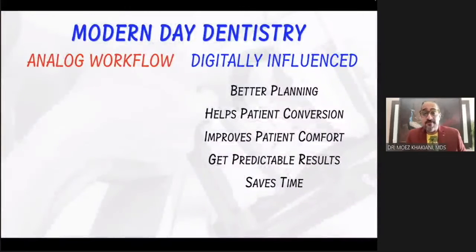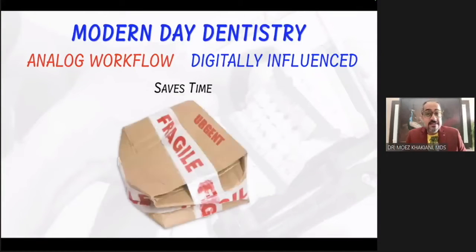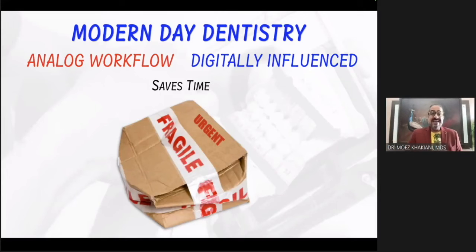And last but not the least, of course, it saves time, right? Why does it save time? Because a whole lot of our time is spent in sending work to the laboratory. खर्चा भी होता है, वक्त भी लगता है, गुम भी जाता है, टूट भी जाता है. अरे यार, ये सब मच कब जाएगी? And that, friends, is again where digital technology comes in. Why? Because everything is now sent digitally to the laboratory. You don't have to send physically things across to them. For small cases, yes, not.